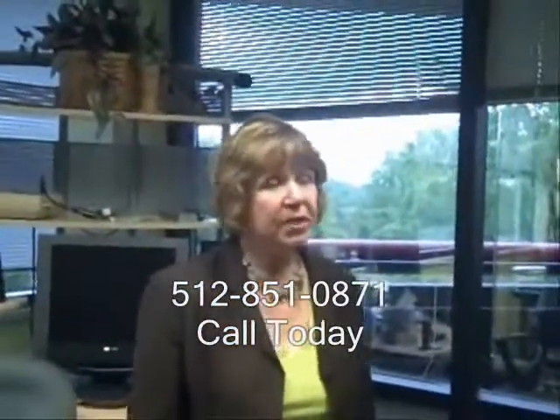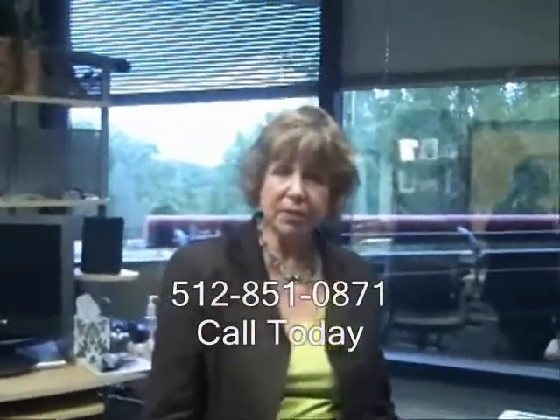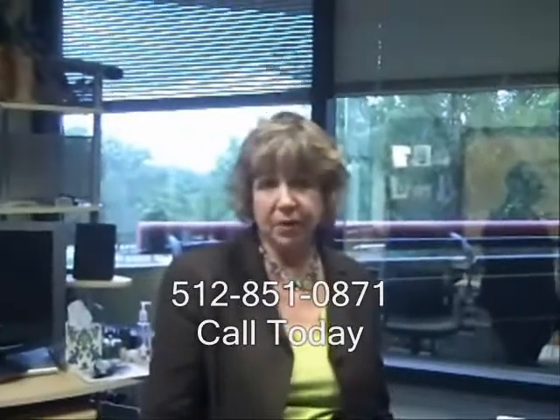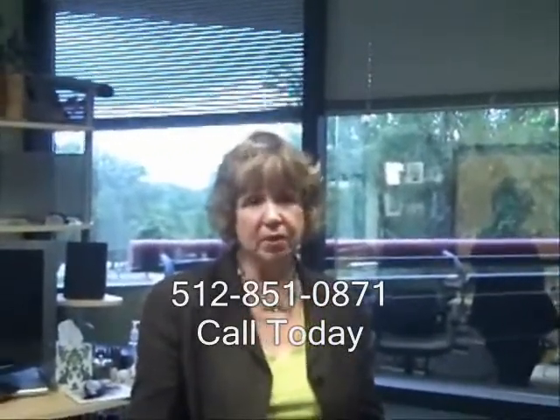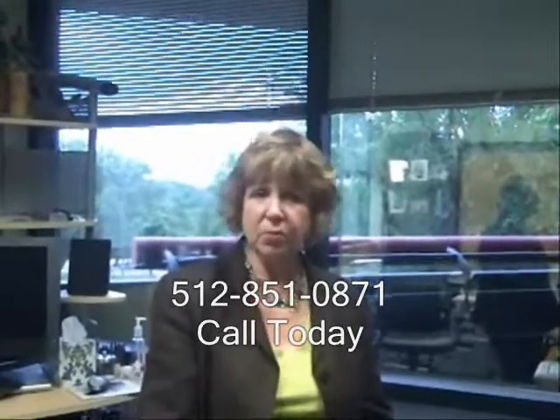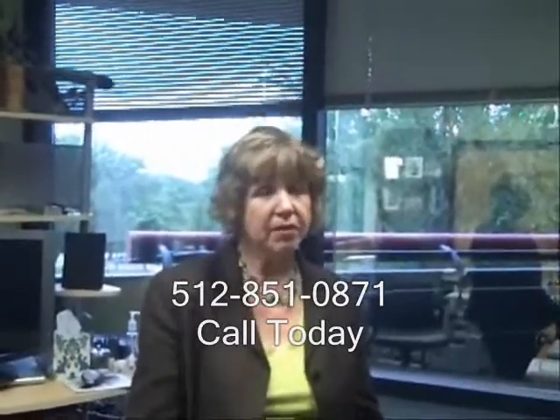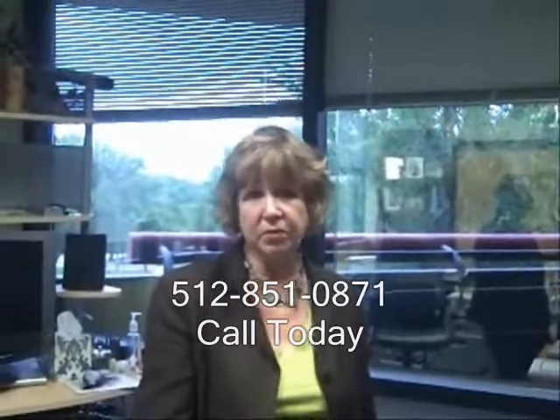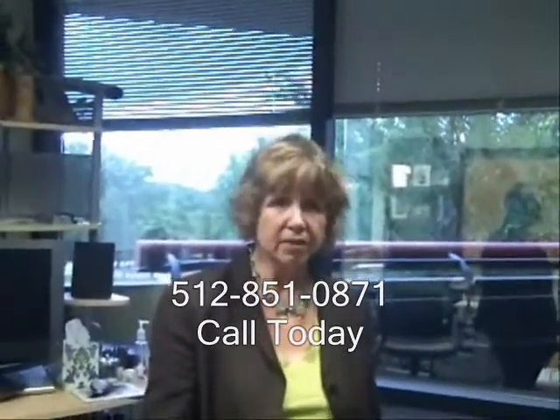A vocal booth is a hearing test booth, and that helps me to make sure that when I'm testing somebody's hearing, I get the best possible responses that I can. I want to be able to find out where you really hear the softest. When I do a hearing test, I want it to be as accurate as it possibly can be. It's really important that it be accurate because otherwise I can't even begin to tell you what you might want to do next or where you stand. So it's really important that I do a good test.